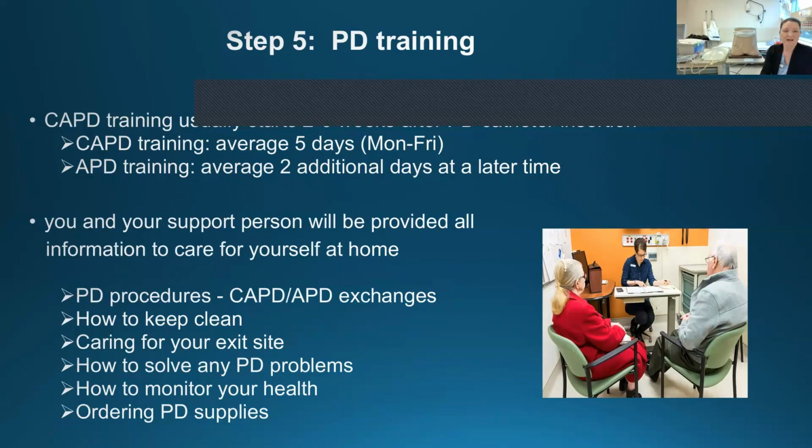During training, you will learn how to do CAPD exchanges and APD exchanges, and how to keep clean for prevention of any infections. You also learn how to care for your exit site, how to solve any PD problems, how to monitor your health, and how to order PD supplies.